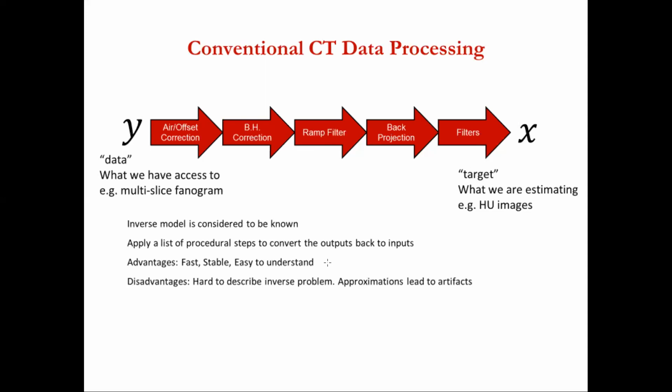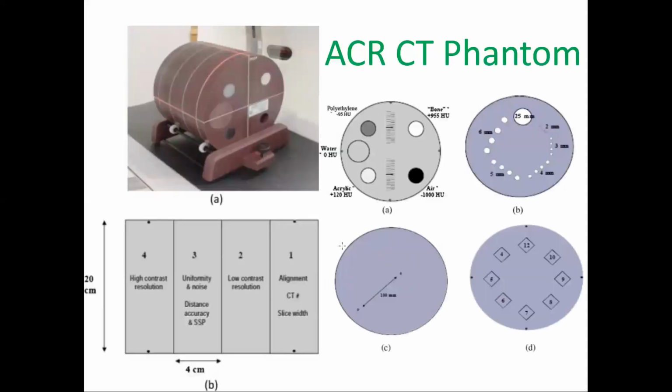So that's why you started off with these analytic reconstruction methods, and that's why analytic methods are still the mainstay. Sometimes in a hybrid form, when you do a few iterations of analytic, which doesn't take much longer than analytic, but the more elaborate things with model-based we'll come to in a moment. Those can take a lot more time. And they came out of a different sort of instrumentation tradition from PET, which had smaller images. So you could have the computational capability to do it in PET before you could really do it in CT. We'll come back to model-based in a moment.